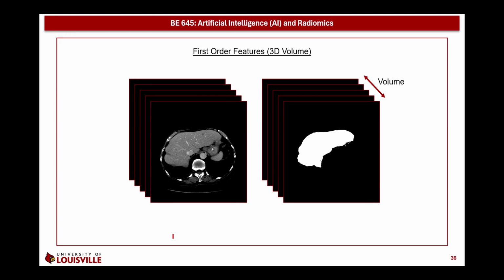But we have different slices. Each slice has a corresponding segmentation, so you will get 75 records. One approach to deal with that: we have 75 slices in that volume, which means we can get 75 records in the database, but to overcome that, we can get the average of the different features in that volume. So we loop on each slice, calculate the features, and then take the average of all of these 75 slices, which will reflect the average behavior of the patient or that case.